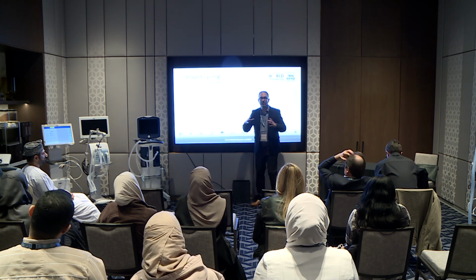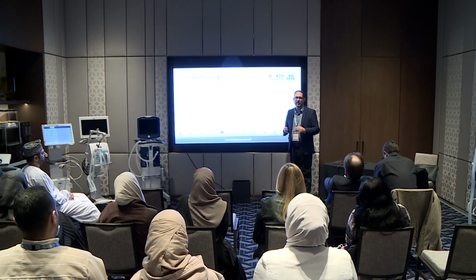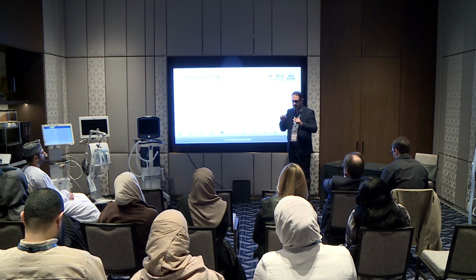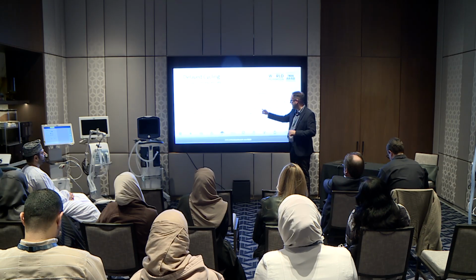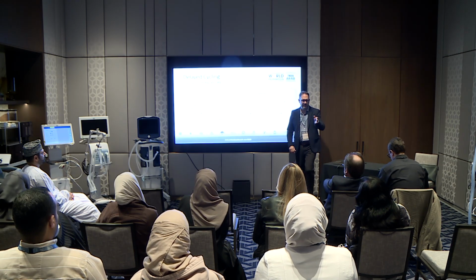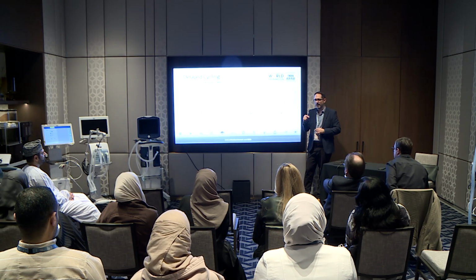And you may give too much volume. So you still end up with hyperinflation, but because you're giving too much volume, you change the patient's effort or drive to breathe. Their effort is weakened. So in between the breaths, because they're hyperinflated, they're trying to trigger and they can't. Okay. Now, Lorenzo had mentioned earlier adjusting PEEP to allow trigger. That is one mechanism for ineffective efforts.